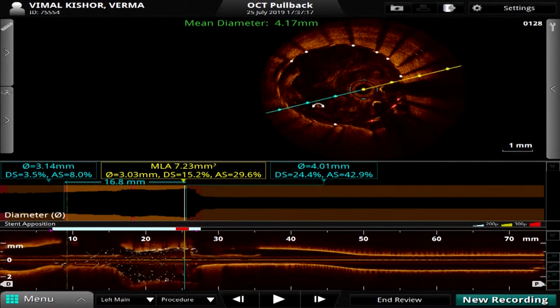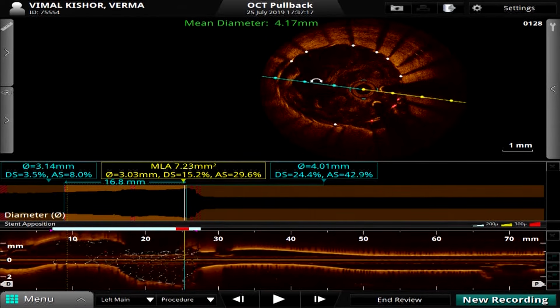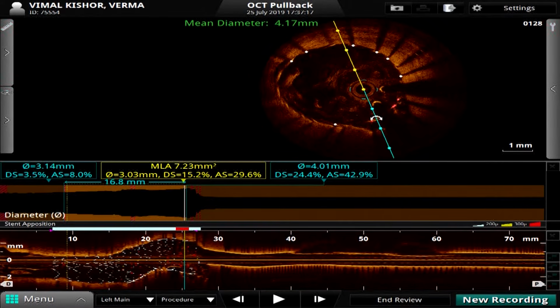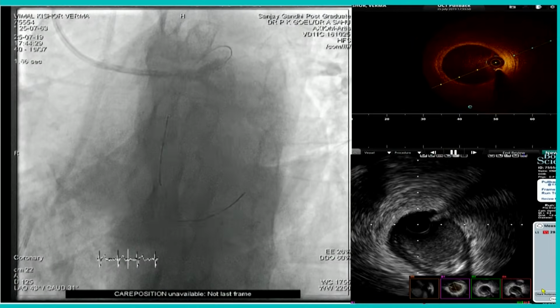I think what's important with ostial left main, when you're doing IVUS, is to make sure your guide is back, so that you're imaging appropriately when you're seeing true ostium. You can anticipate that, because the left main is so big, the 4.5 can be not enough. We also did a withdrawal toward the circumflex. And can you show the circumflex hole on the 3D? We can also see the hole of the circumflex.